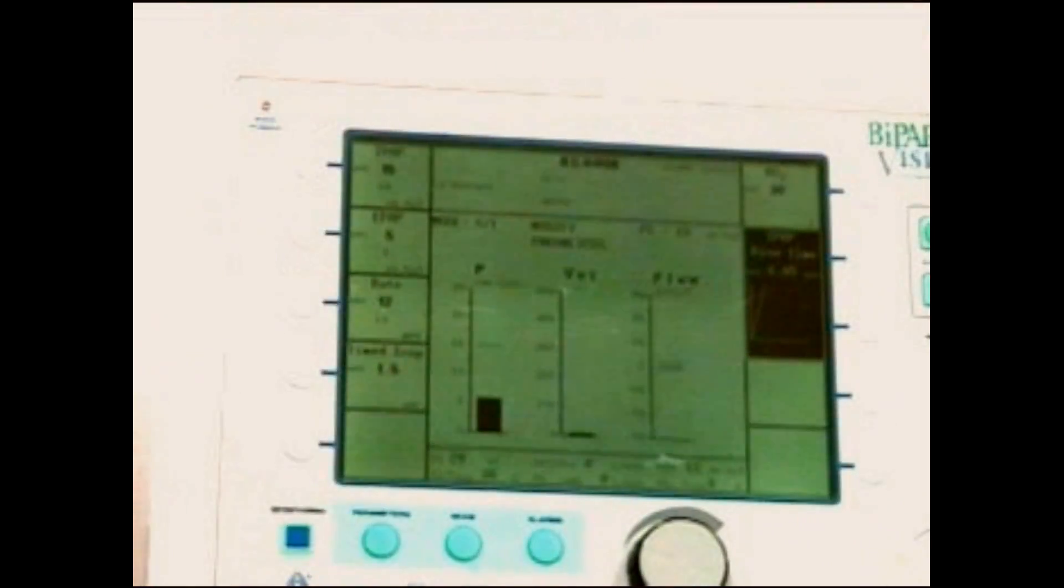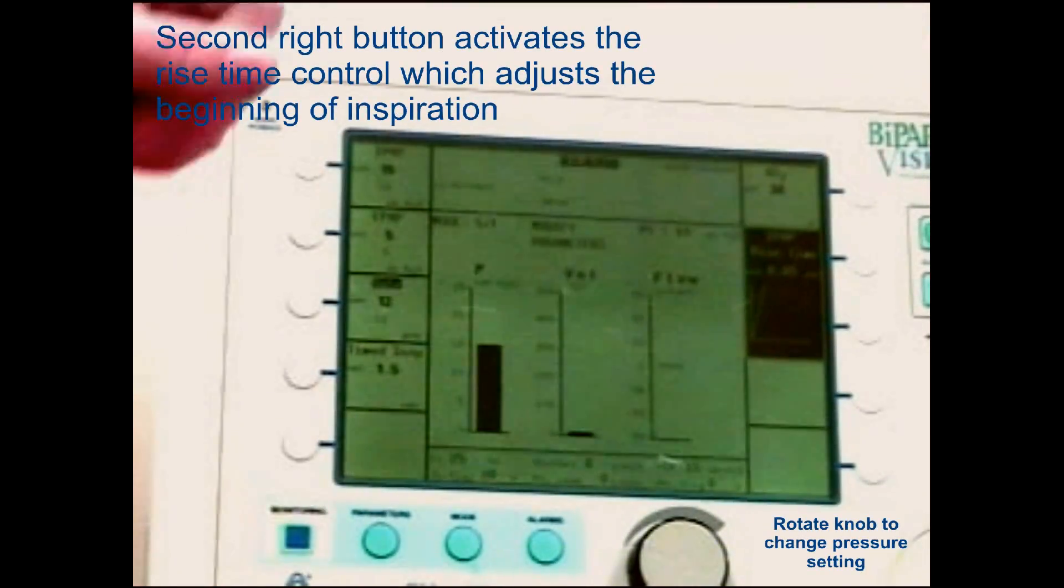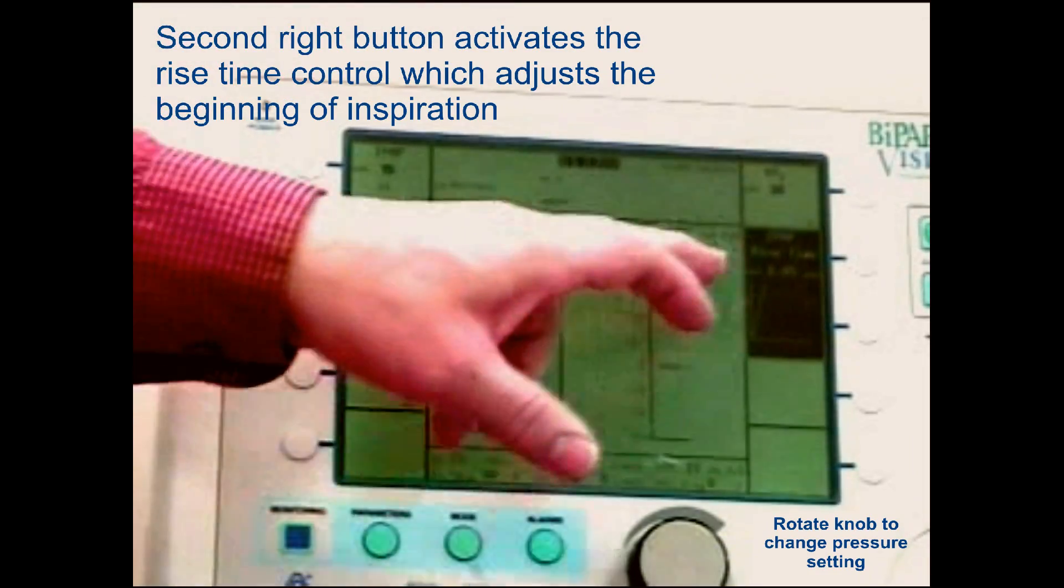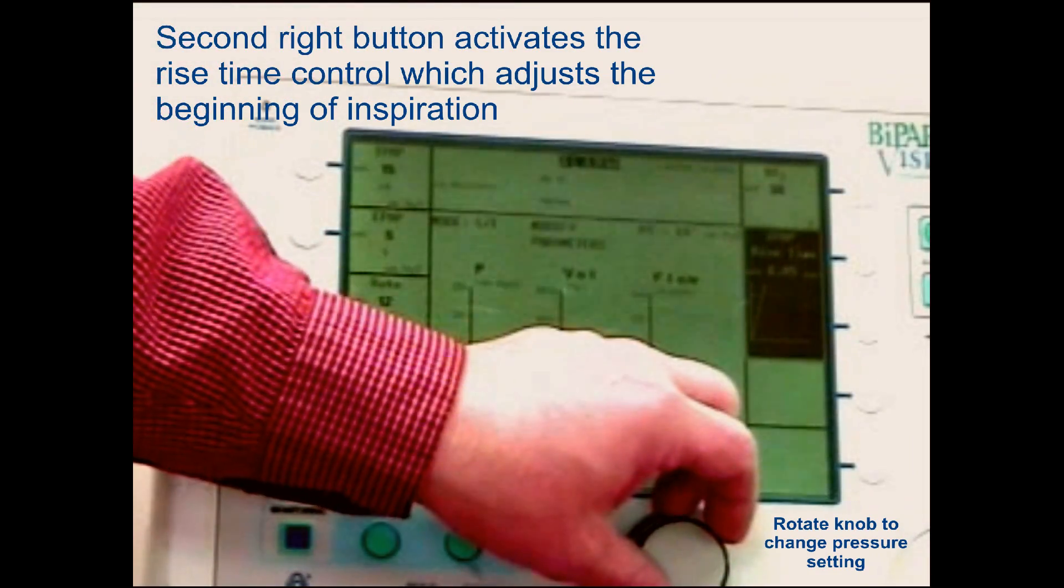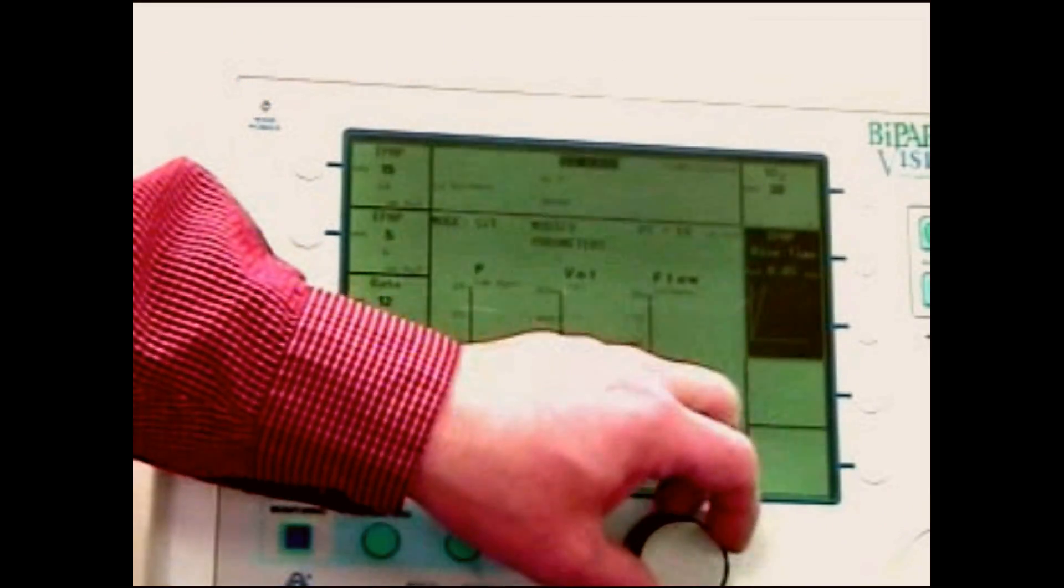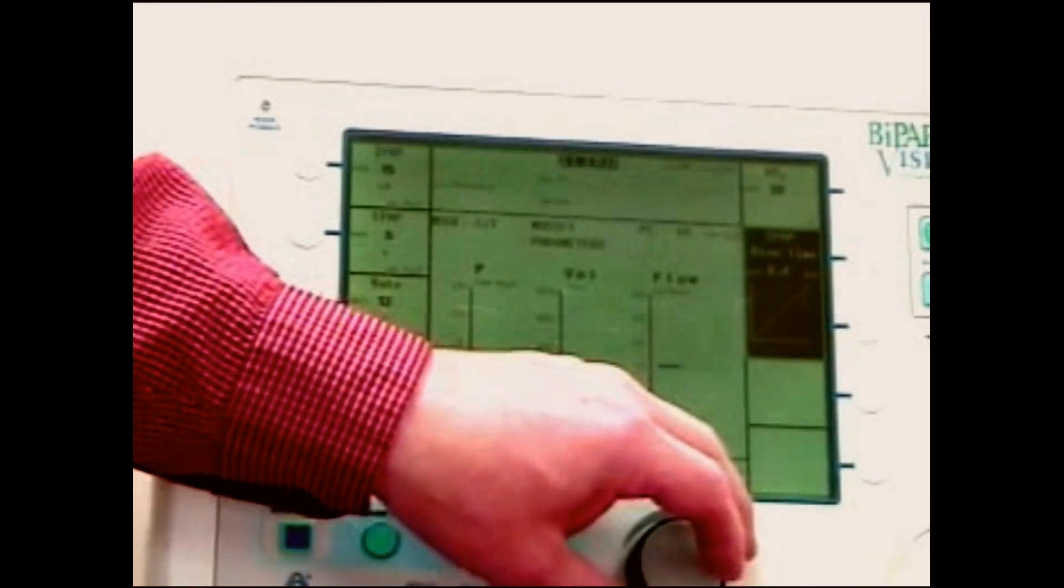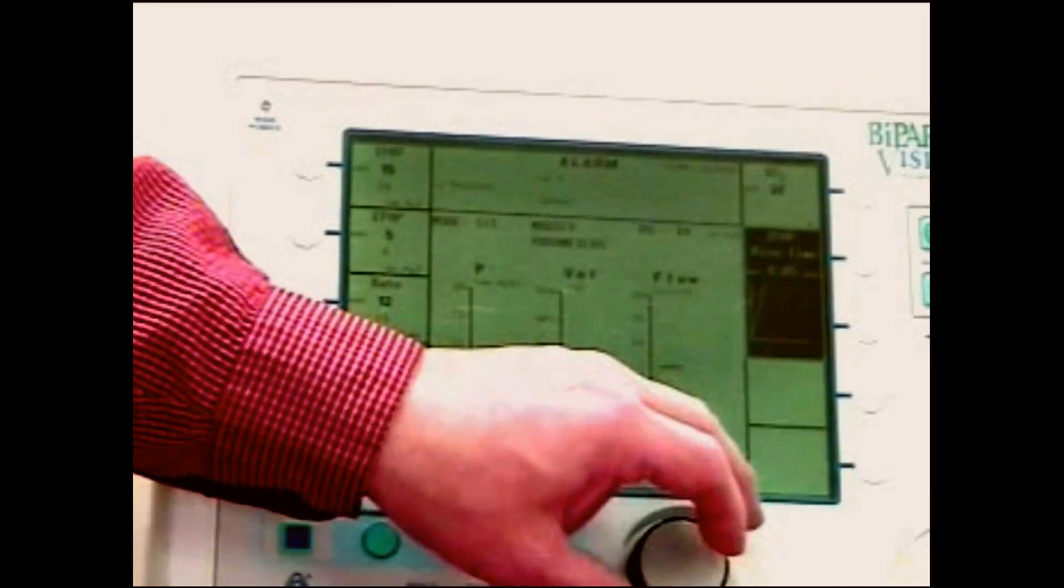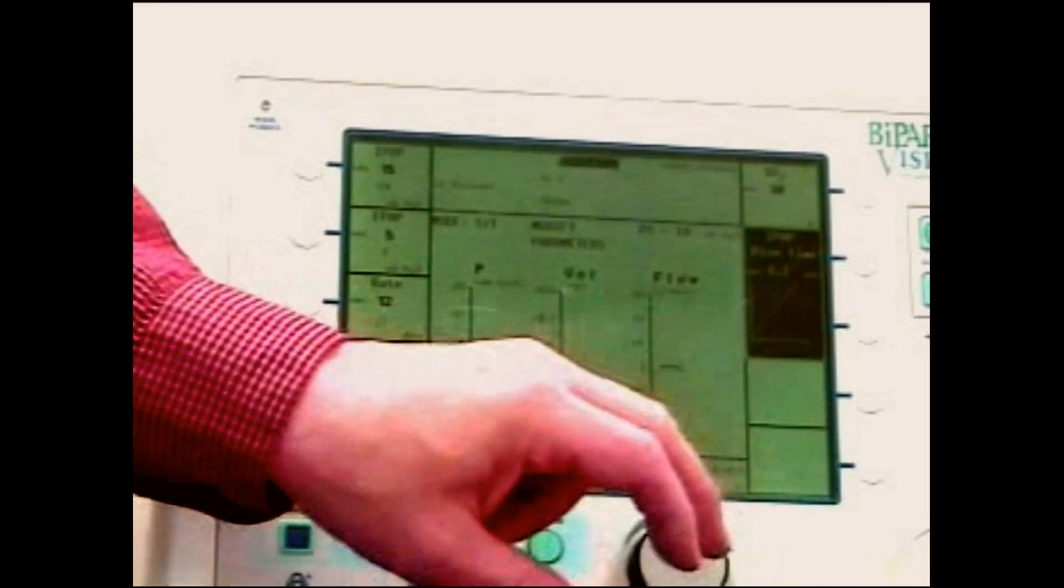And then rise time. Rise time is the speed at which the air initially goes to the patient. If you want it faster, you go .05 or as slow as .4. We'll select for this patient a .2.